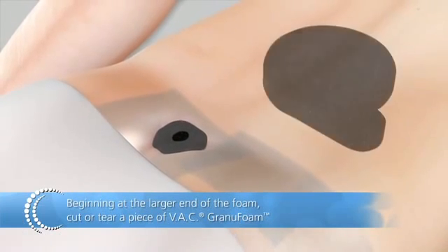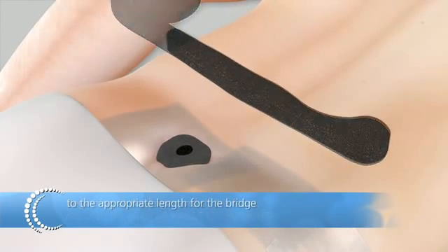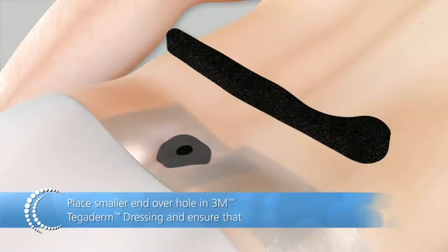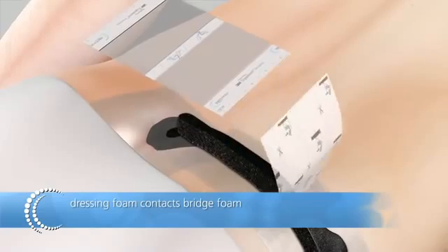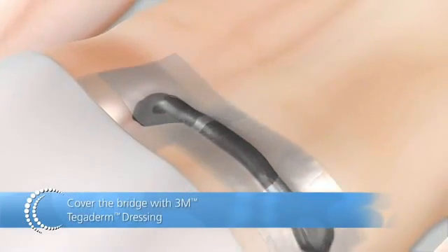Beginning at the larger end of the foam, cut or tear a piece of VAC granufoam to the appropriate length for the bridge. Place smaller end over hole in 3M Tegaderm dressing and ensure that dressing foam contacts bridge foam. Cover the bridge with 3M Tegaderm dressing.